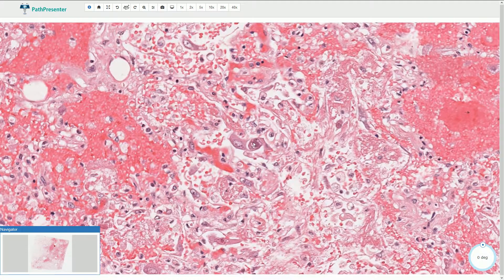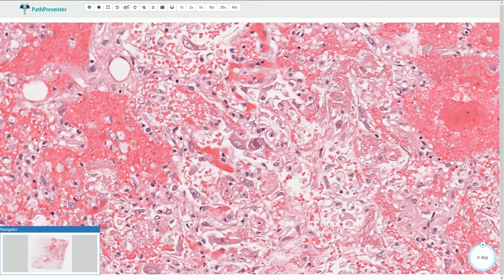Sometimes it is really difficult to find, but here we are looking at the intranuclear inclusion, which is quite large, basophilic, and round to oval shaped. It typically shows a halo around the inclusion, and the nuclear membrane is then more prominent. This is a typical appearance of the cytomegalovirus intranuclear inclusion. Here we very probably have another one.